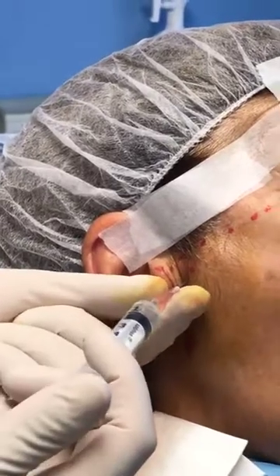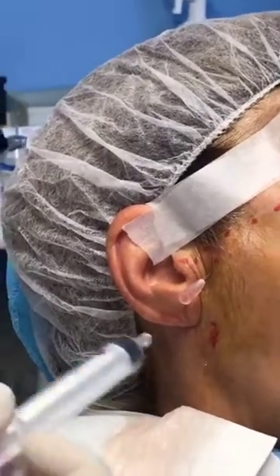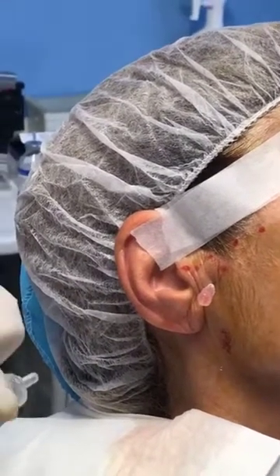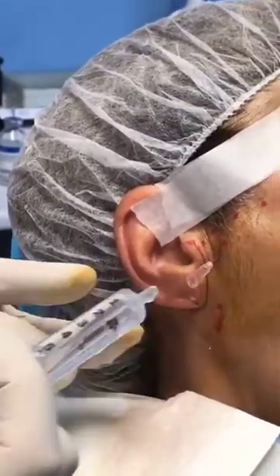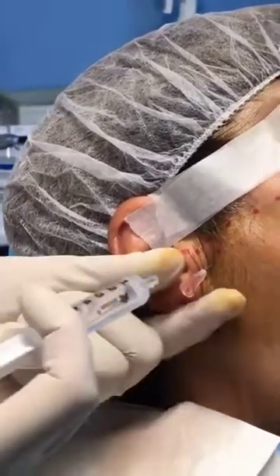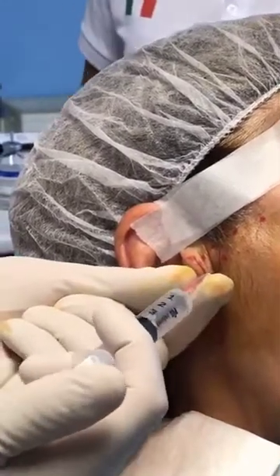Usually you can ask a patient to open and close their mouth. Close, please. If you don't have any resistance, you can just leave the patient with an open mouth. You have to stay around, because if it works too properly, there is a risk to stain your shirt.